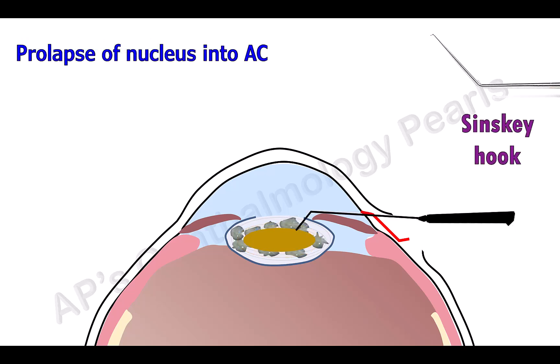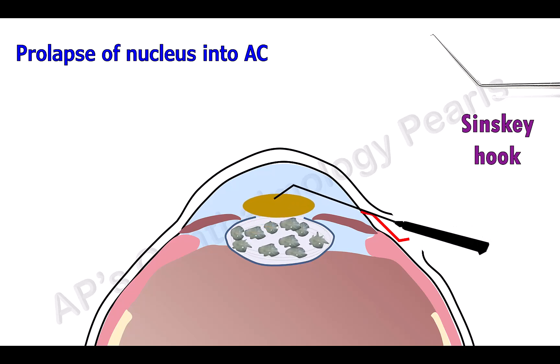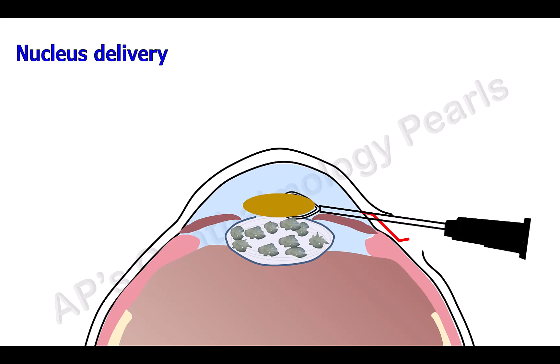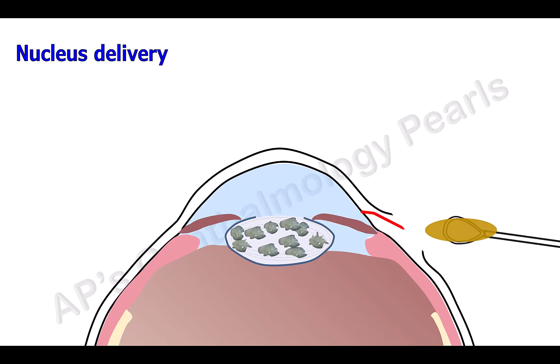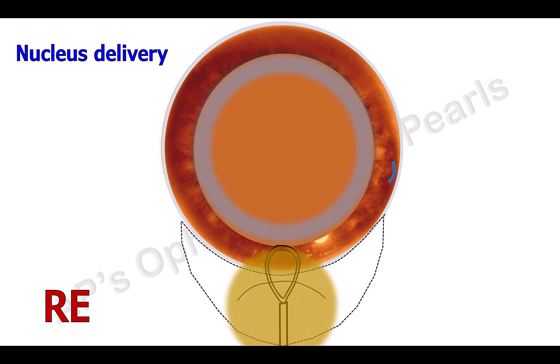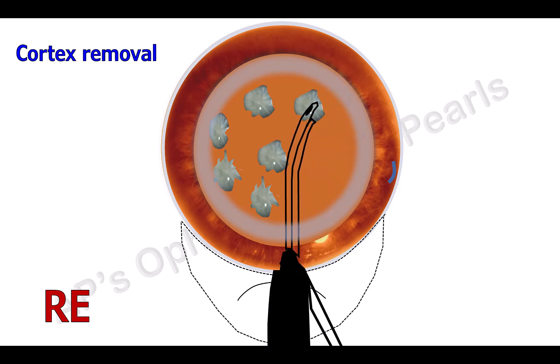The nucleus is then prolapsed into the anterior chamber using a Sinskey hook, and then removed from the eye with the help of a wire vectus. Cortex is then removed with the help of a Simcoe irrigation-aspiration cannula, while simultaneous irrigation is done with BSS.